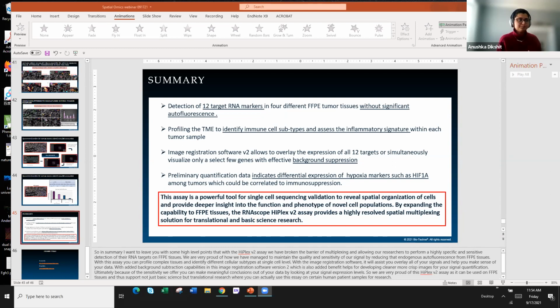And I think there's a sensitivity question. In our technology paper, we have seen that we can actually detect single molecules. So in theory, we detect each and every molecule of RNA, but sensitivity can be impacted by a lot of other factors: sample type, your workflow, technical considerations. Considering all of that, we have still seen a very high level of sensitivity, upward of 90%.